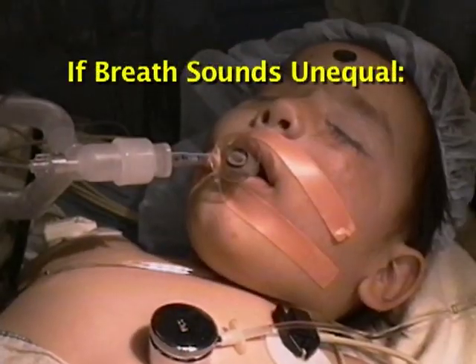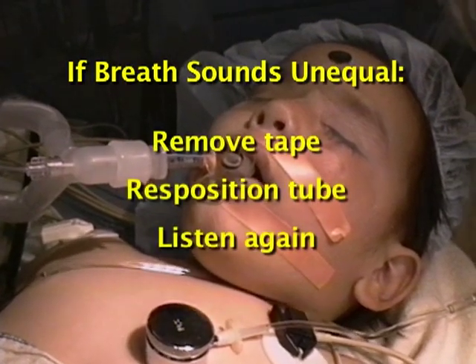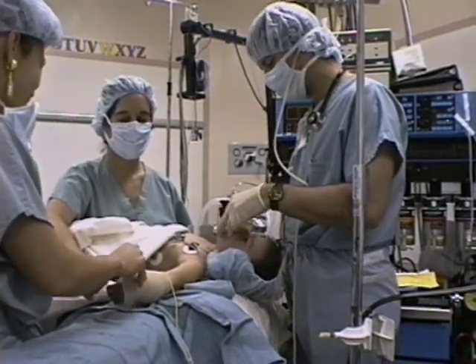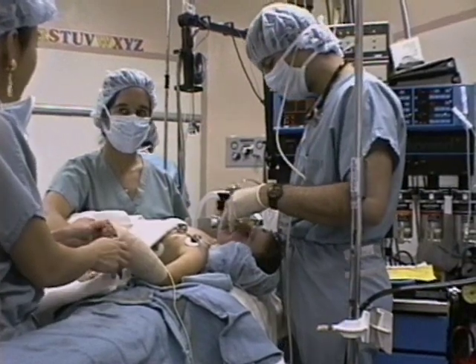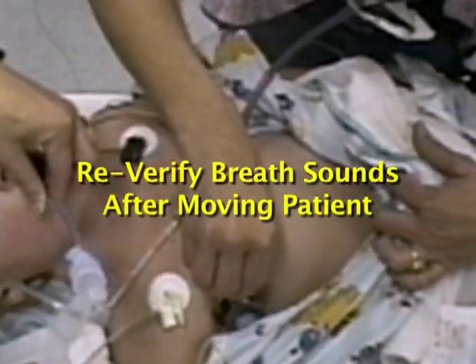If they're no longer equal, remove the tape, reposition the tube, and listen again. Even after it's taped, hold the tube securely when moving the patient. Tubes frequently move during transport. Re-verify placement after every move.